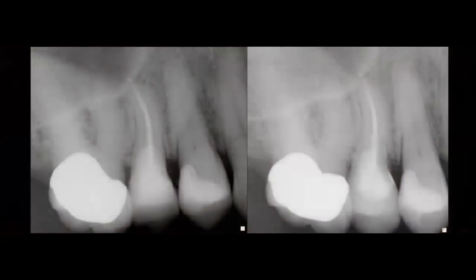So, I wanted to share with you also the x-rays. What you're seeing on the left-hand side is the periapical x-ray after I bonded the temporary using flowable composite. So this is the same day that I did my core buildup and that I obtained my scan. You can see that there is no space in any of the layers. Everything seems to be nice and uniform throughout. You're not seeing the fiber in the x-ray because the fiber is placed from buccal to lingual, so the x-ray beam is just going through it.